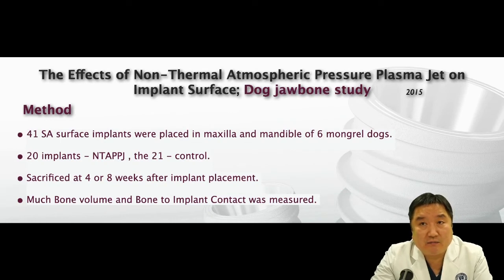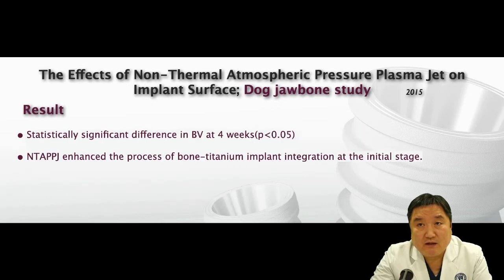This is my plasma study that was performed in 2015. I wanted to see if non-thermal plasma would have a very similar effect to UV light irradiation. So we placed 41 SA implants in 6 dogs and sacrificed at 4 and 8 weeks after implant placement. The result shows a statistically significant difference at 4 weeks after implant placement.